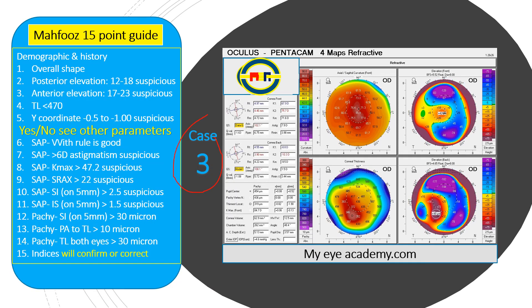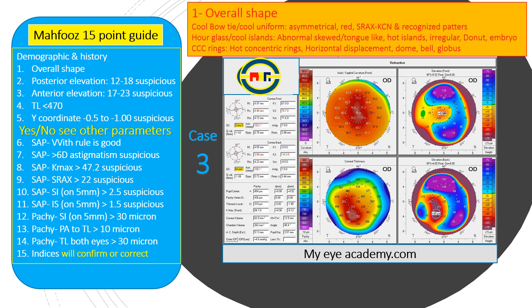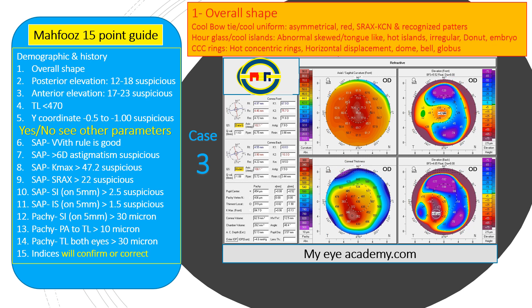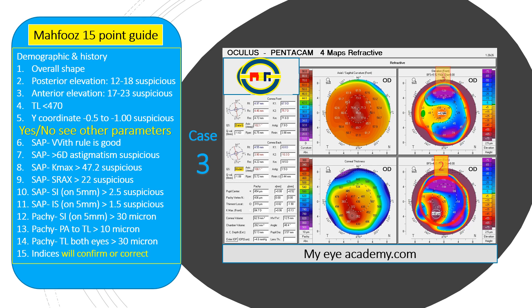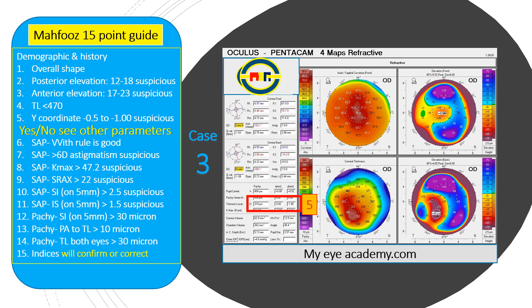In case three, the shape on the sagittal map is red, on the elevation map it is an abnormal shape, and on the pachymetry map it shows hot irregular concentric rings — all abnormal shapes suggesting an abnormal cornea from the very start. The anterior and posterior elevations are very high, the thinnest location is less than 470, and the y-coordinate is more than one. All five parameters indicate it is an abnormal cornea.